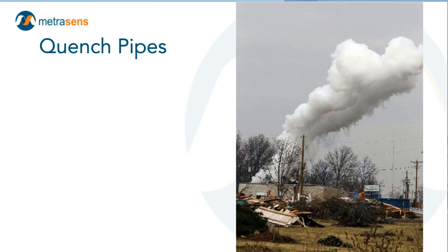What you're seeing is, because the helium gas is so cold, you're seeing the water vapor condense and form a cloud, form snow. And so this is frozen water vapor that is rising up because the helium is buoyant. It's lighter than air. It's carrying this water vapor, frozen water vapor, up as it goes.